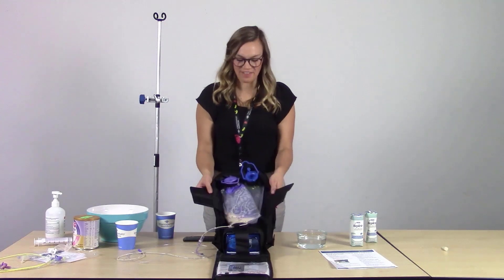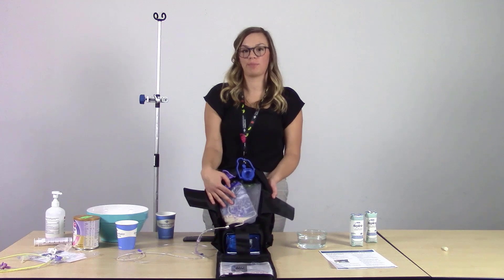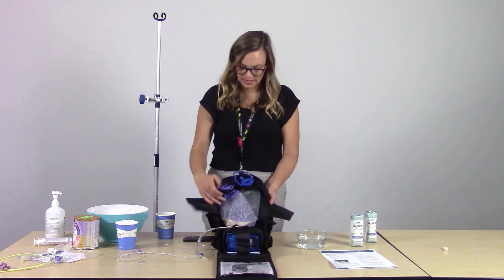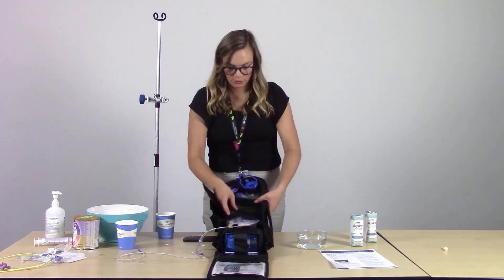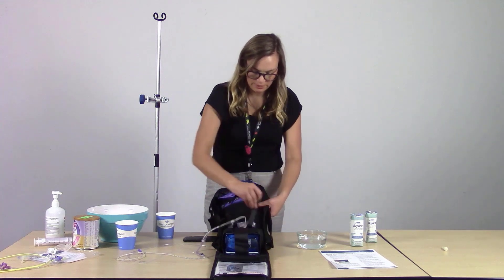I've added the feed and flush bags into the back section of the backpack. I secured the neck of each bag set with the clasps, then put one set of velcro over the top and secured with the velcro straps.